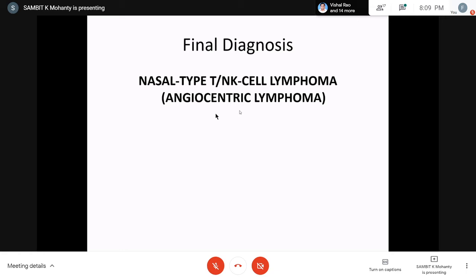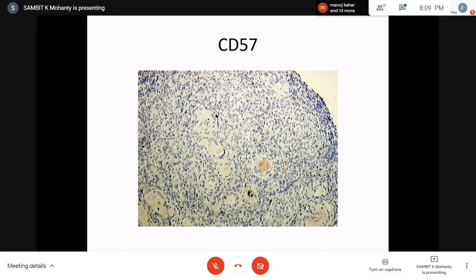So the next one. Sir, you asked us to think something benign. Anything in particular you wanted to discuss, sir? Because the history is that it is in the uvula, in the soft palate.